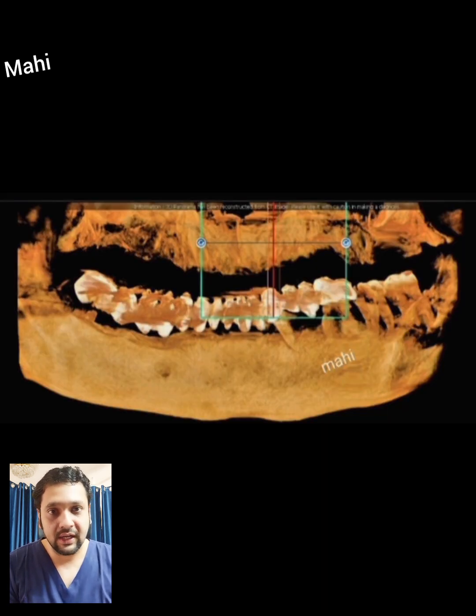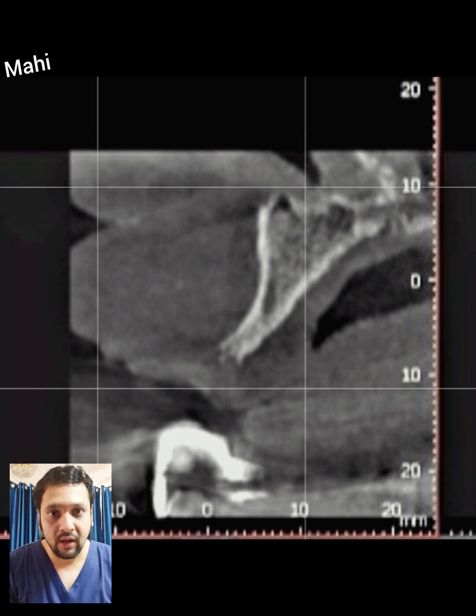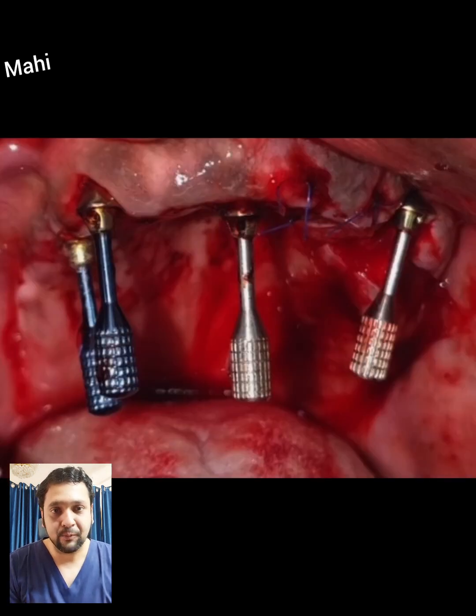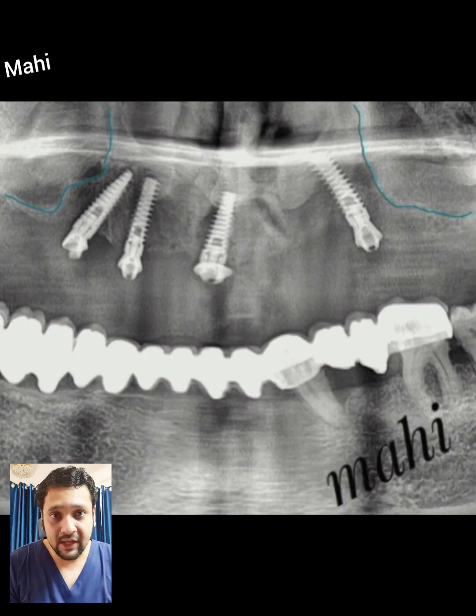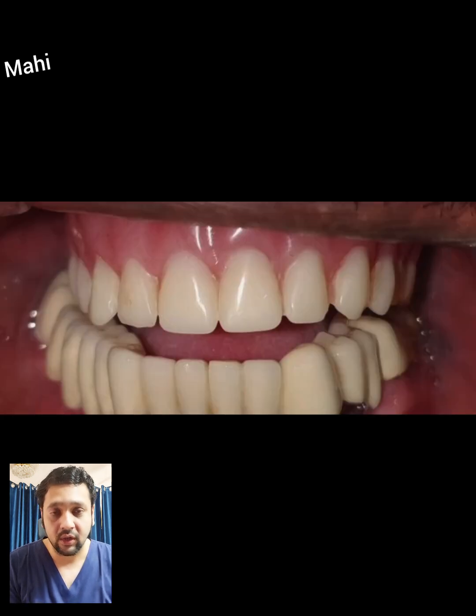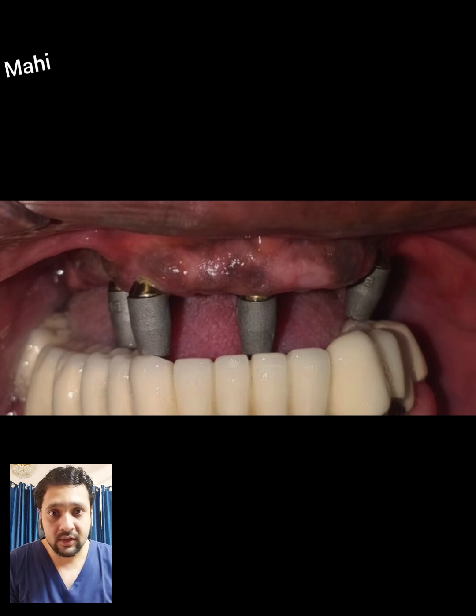Here the material that I've selected for the prosthesis is a cobalt chromium bar on which a zirconia superstructure is luted. As I have ceramic on the lower arch, I could go with zirconia. But if you have a denture on the lower arch, it's better you go with acrylic. If you have natural teeth on the lower arch where dentine is exposed or the enamel is shattered or broken down, then you can go with ceramic, which is softer than zirconia. In such cases, avoid zirconia. Avoid zirconia in parafunctions. Avoid zirconia in a patient with muscle pain or TMJ pain because it loads more.